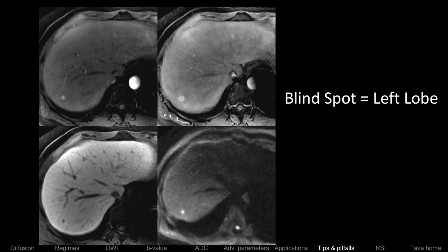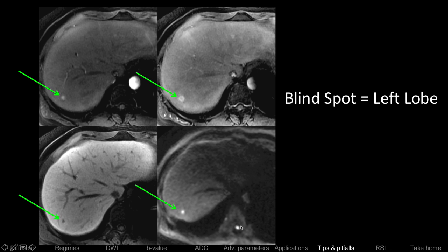Pitfalls: blind spots. Here's a patient with cancer in the right lobe of the liver on gadolinium and on diffusion. But what's happening in the left lobe? There's a lesion — is that a met? I don't know, because the left lobe of the liver sits right underneath the heart. The heartbeat causes lots of signal loss, so the left lobe is often a blind spot on DWI. DWI is very powerful for the right lobe, but not as great for the left lobe.